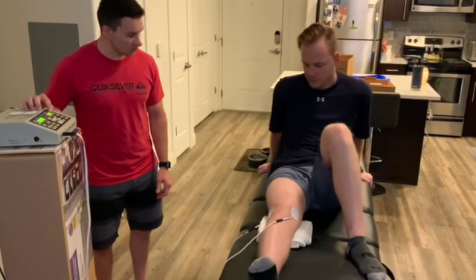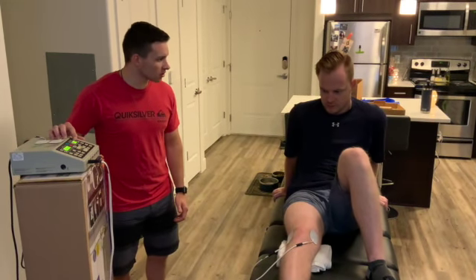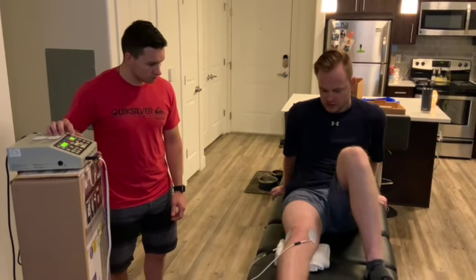Yeah, I'm starting to feel it. Okay, so now what we want is for it to be comfortable on there, so we don't want it to hurt or anything. Once it gets to that point, just let me know, okay? Okay. That's good. Okay, sounds good.